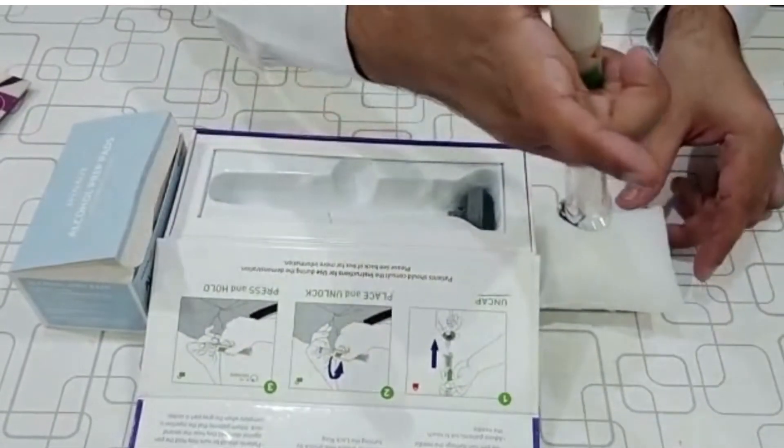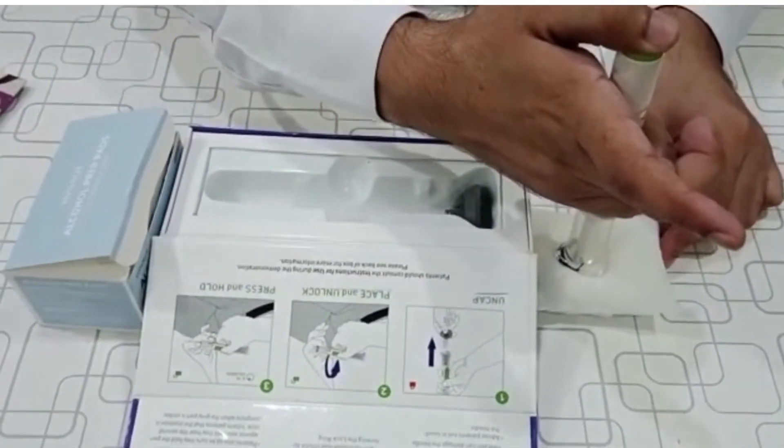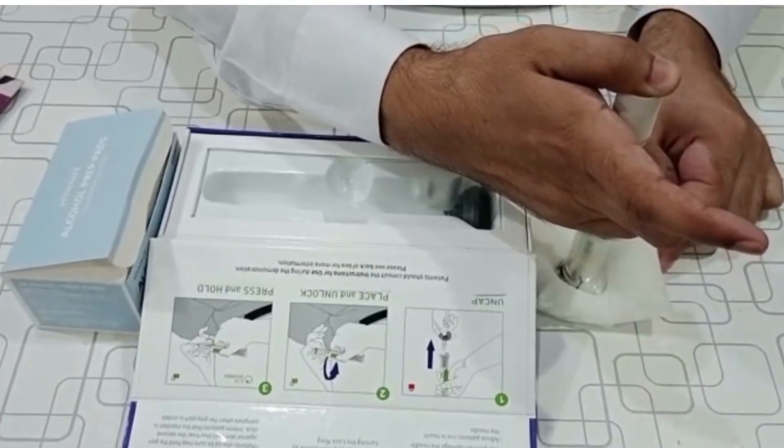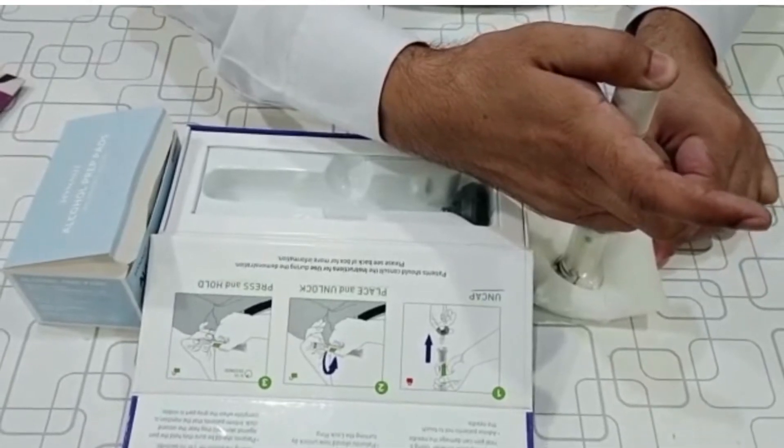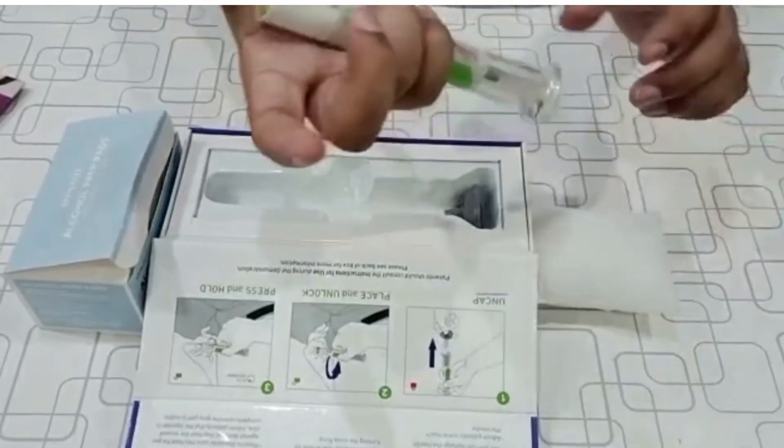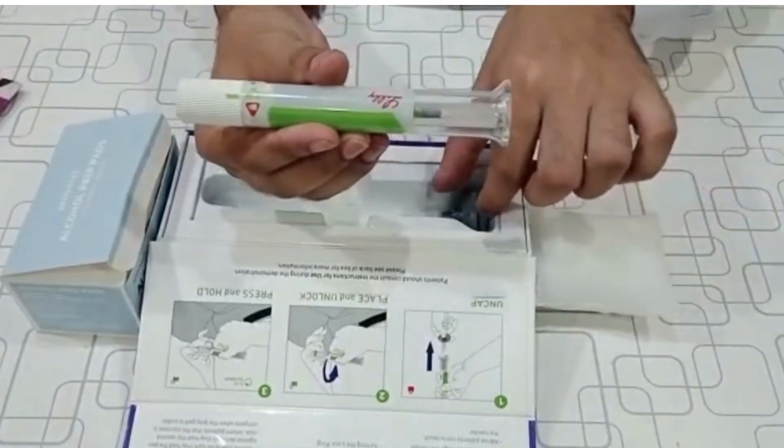When you are injecting the medication, first unlock the pen and then press the button. You will hear a click voice, then hold and wait for the next click. After a second click, the whole drug is delivered. Then put the cap on pen and discard it.